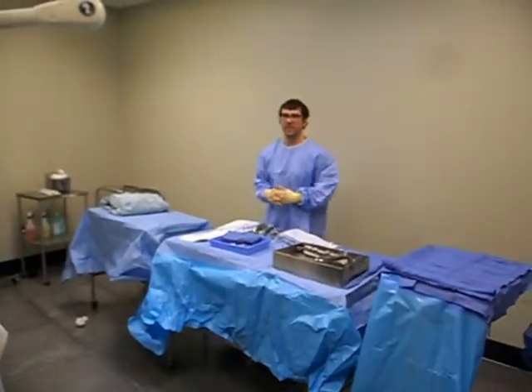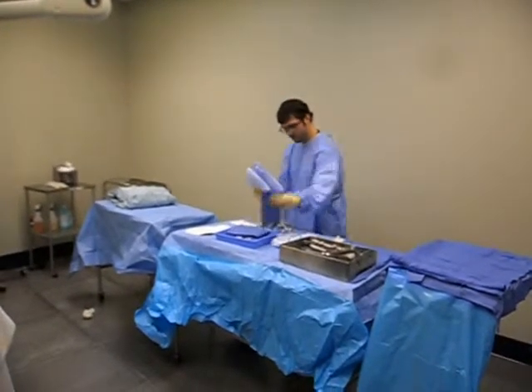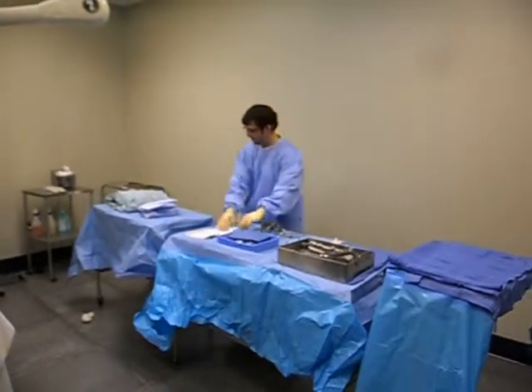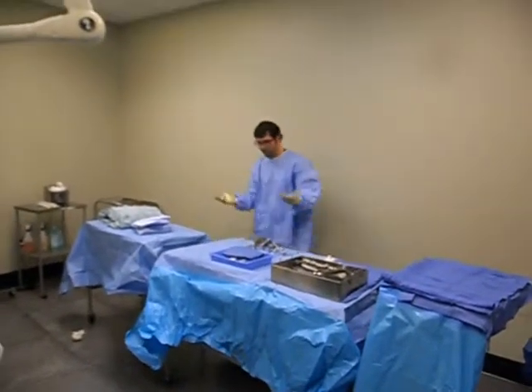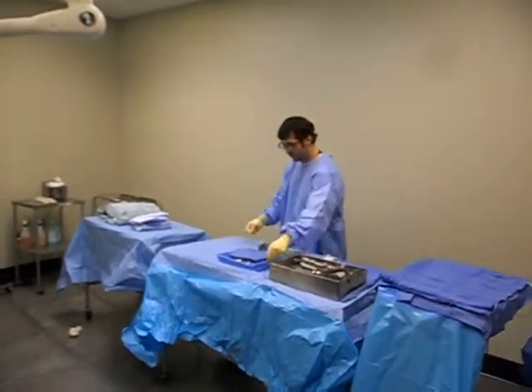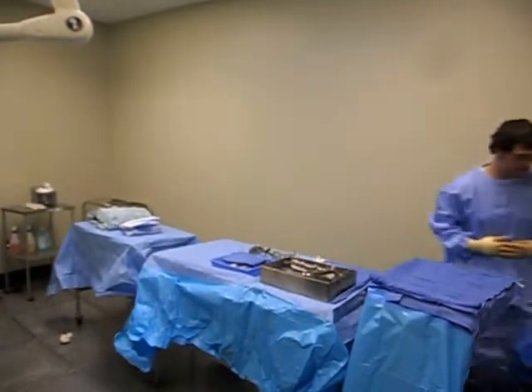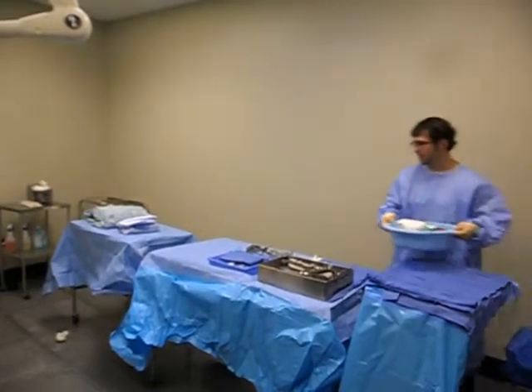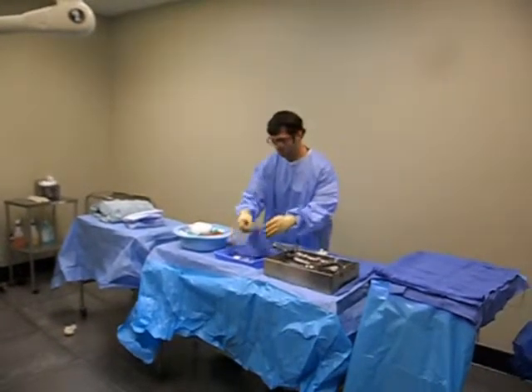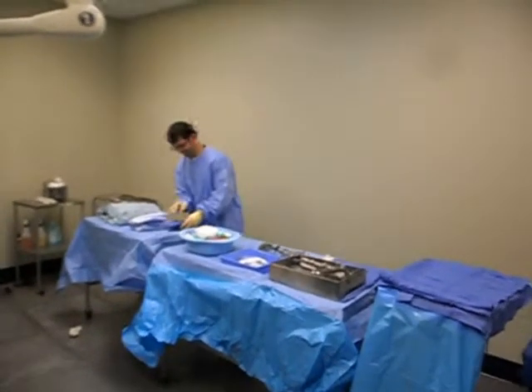I'm new, that might be something I need to learn about. I'm going to put all my, discard that now, it's contaminated. Garbage. Okay, this is really quick. In the shuffle. Do you have the towels for your drape? Might not have. No. You got it. Okay. Thanks.